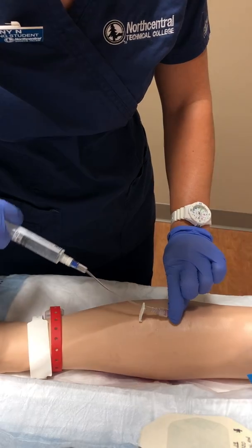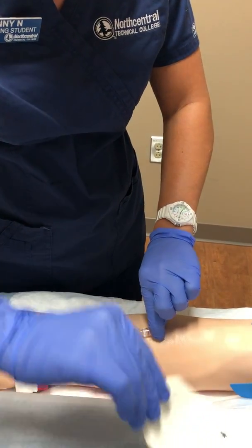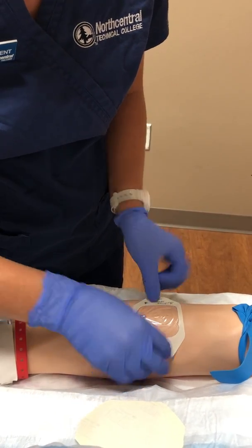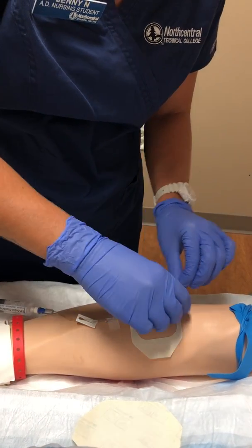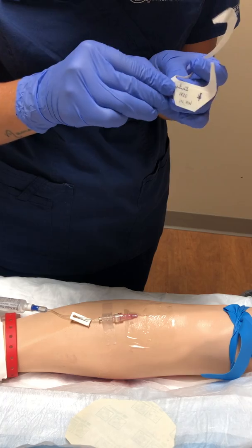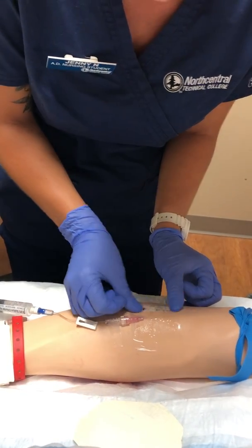How are you doing, Mary? She says she's doing fine. Very good. I'm just going to kind of tape it here, kind of secure it in place. And I'll apply the dressing, making sure not to touch the middle of my dressing. And remove that. I did make sure to label date and time beforehand, so I'm just going to apply that. This is important so we know when the IV was placed, and it was a 20 gauge needle.